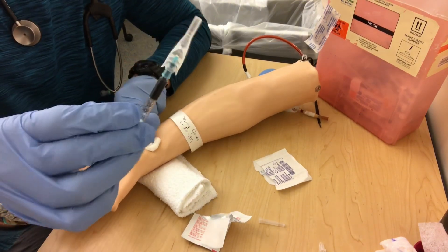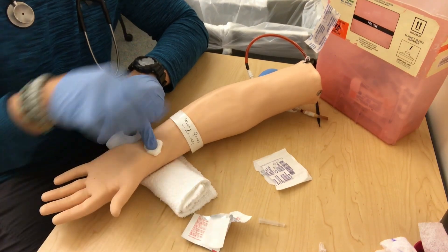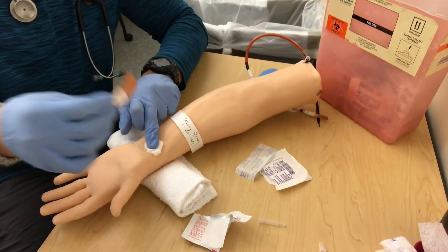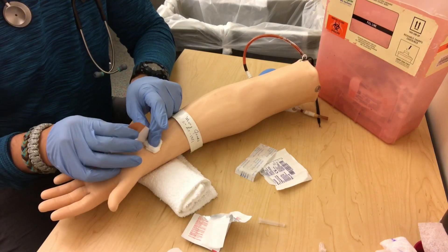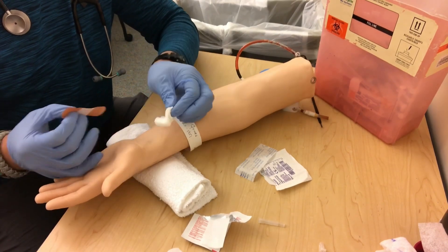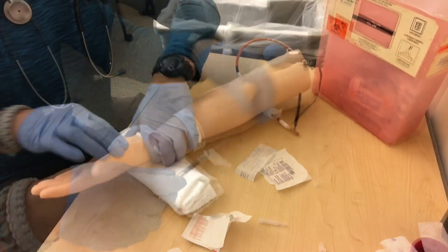Once I get that, grab the 2x2 and hold pressure, then cap the needle. Hold pressure while you grab the band-aid that's already out. Put it on tightly. How long do we hold pressure? Five to ten minutes or as needed, depending on the patient and how much they're bleeding — check it, make sure bleeding has stopped.